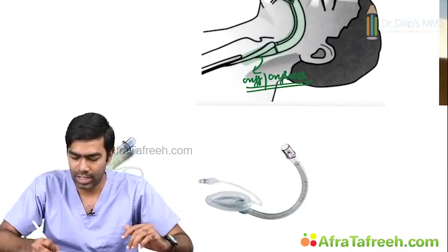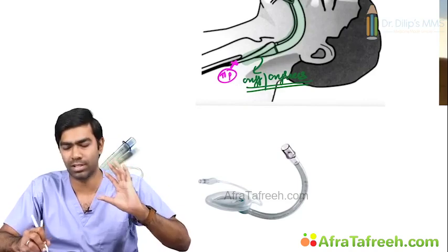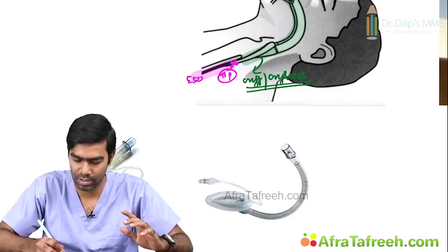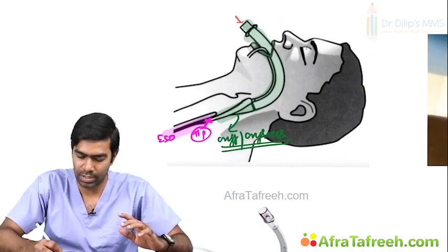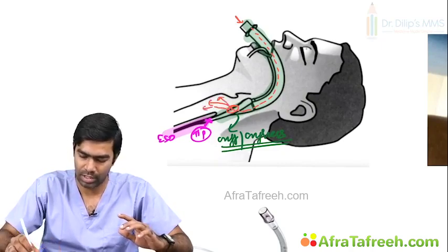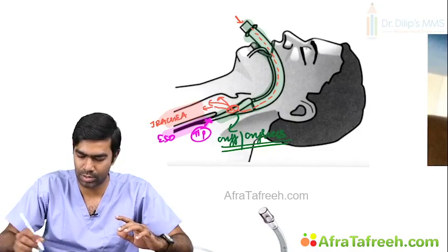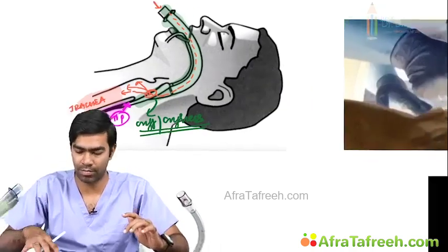And the distal tip of the airway, the tip of this mask, it could be cuffed or cuffless, doesn't matter. The tip of this mask is going to be at the proximal portion of the esophagus. So this is the esophagus. So they're going to rest on the proximal portion of the esophagus. Whenever you ventilate this patient with air, it will usually enter through a port in the mask, and it will be entering the tracheal lumen like this. So this is the basic functioning of how an LMA works. Clear? They provide a perilaryngeal seal. Either they can be cuffed or they may be uncuffed.